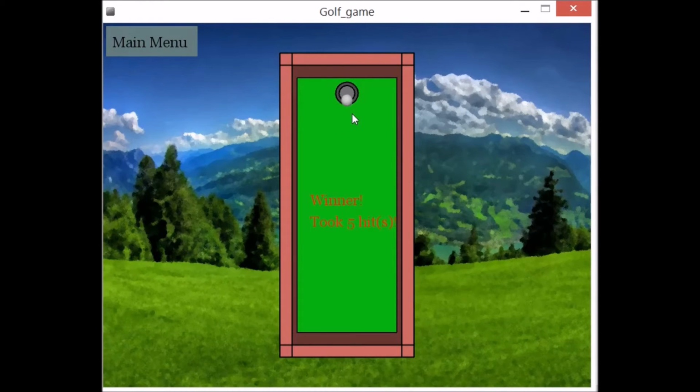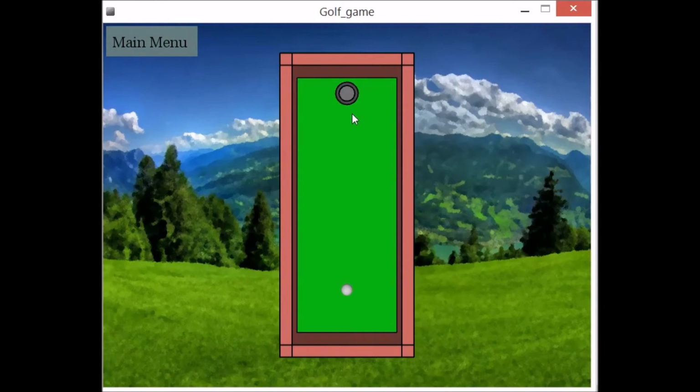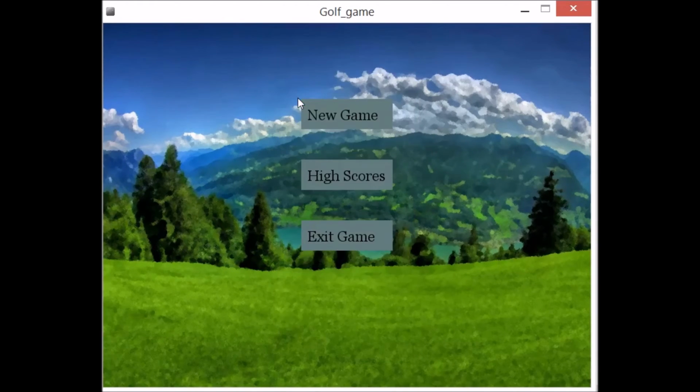And you can see once I make it, I'm a winner, and it took me 5 hits, and it brings you back to the main screen. So now let's see if I can do it a little bit quicker. So if I try really hard, I can get it about halfway. Let's see if I can get it to the end. Almost. All right. So, it ended up getting there in 2. So that is the basics of how the game works.